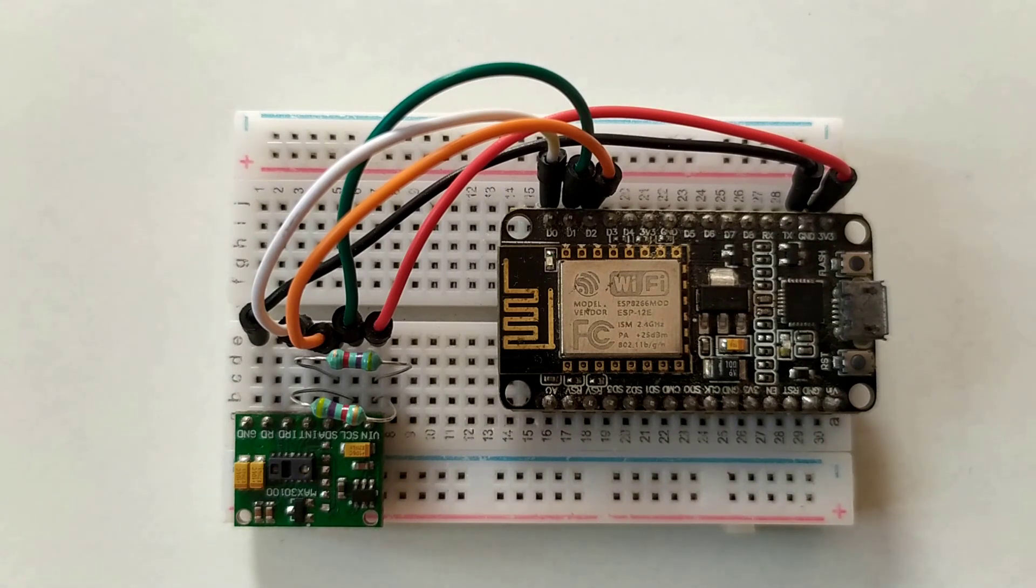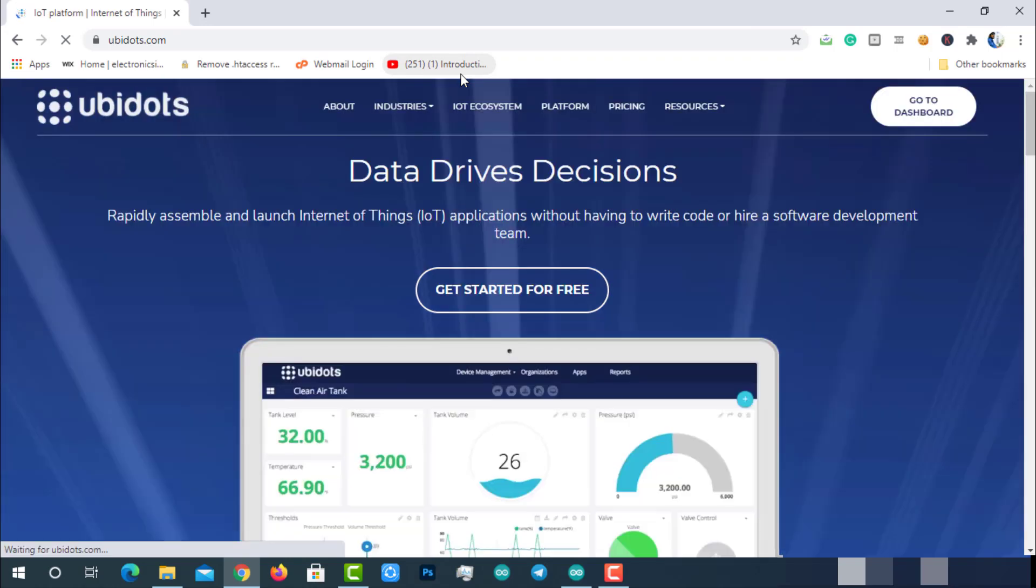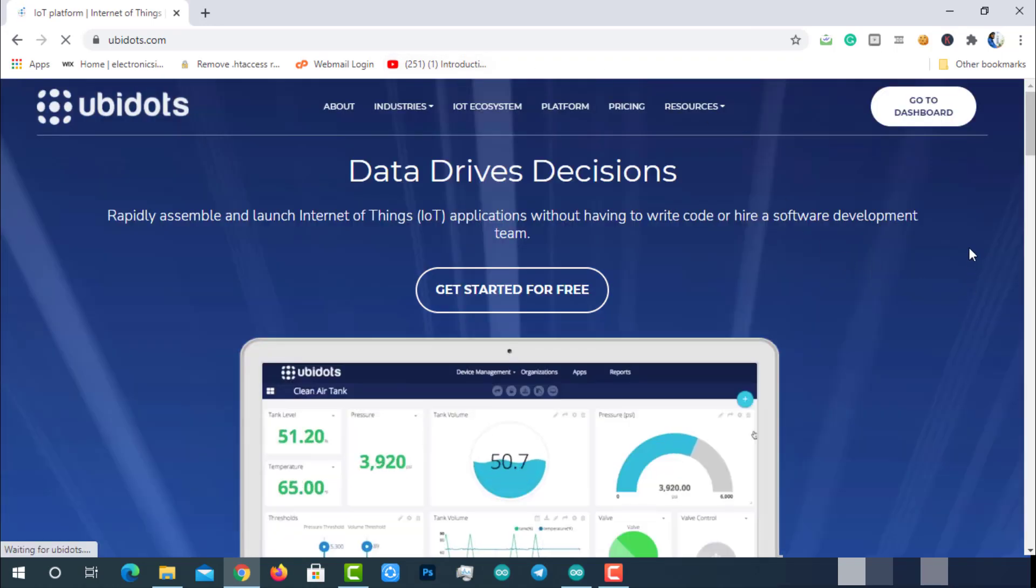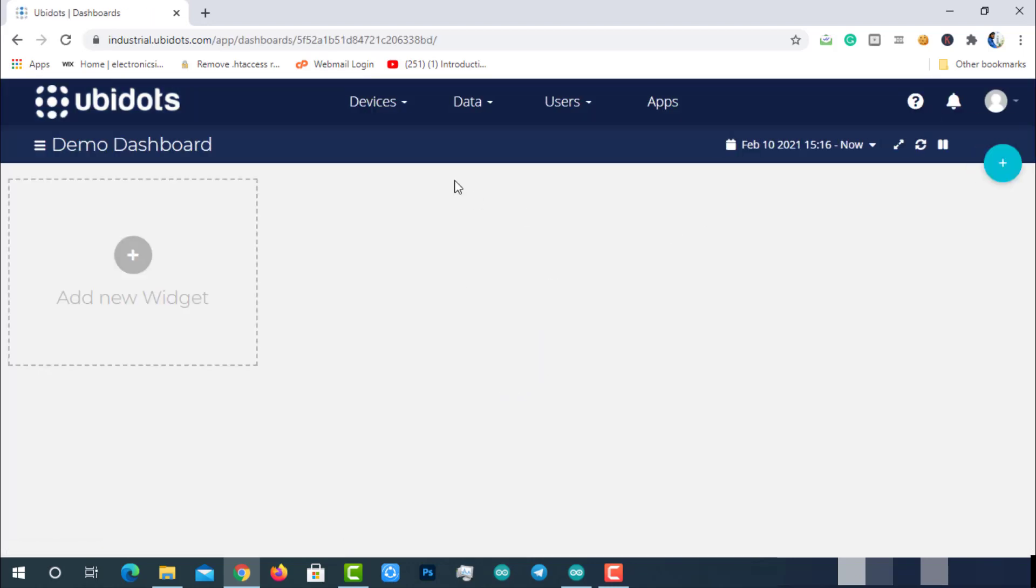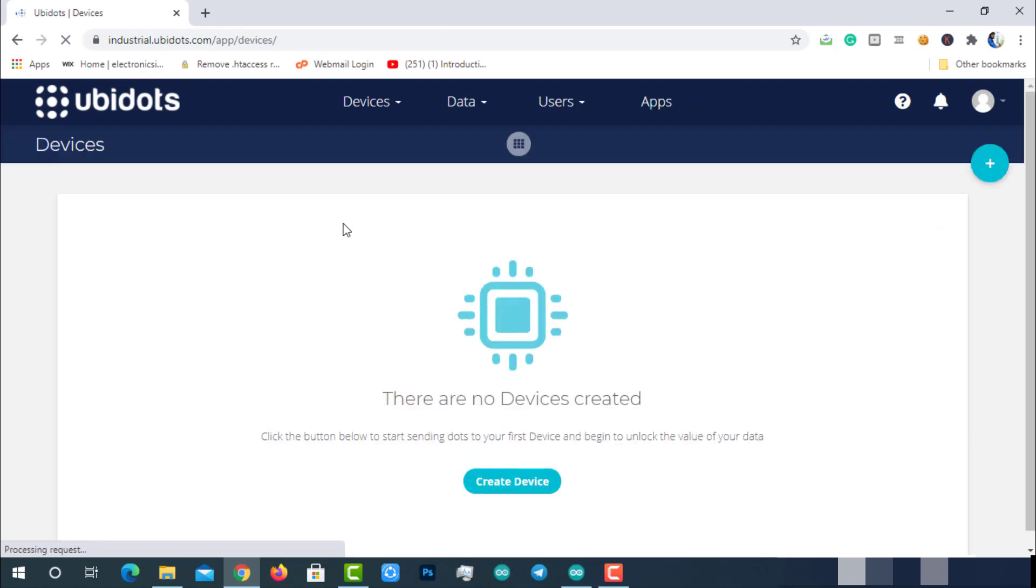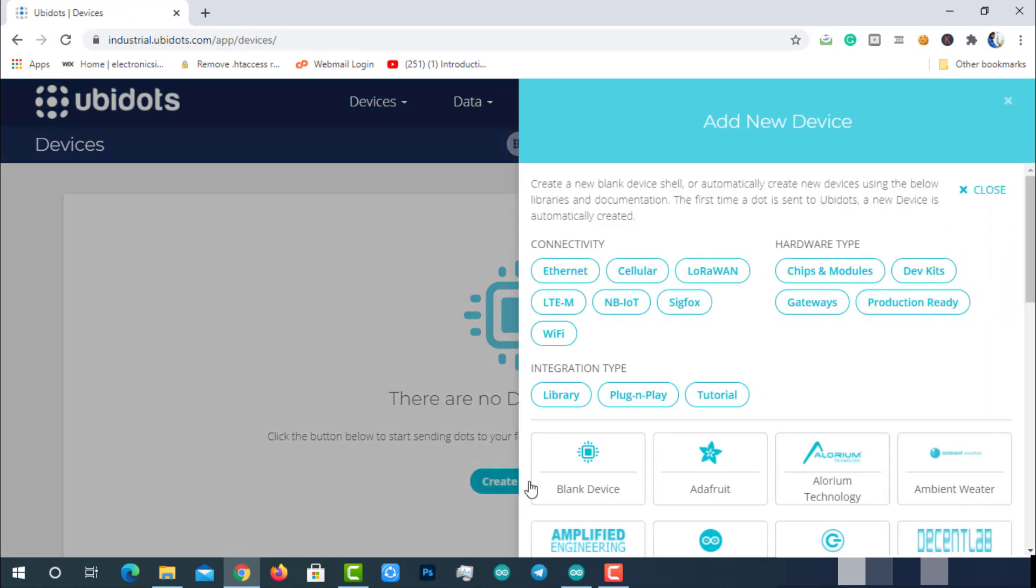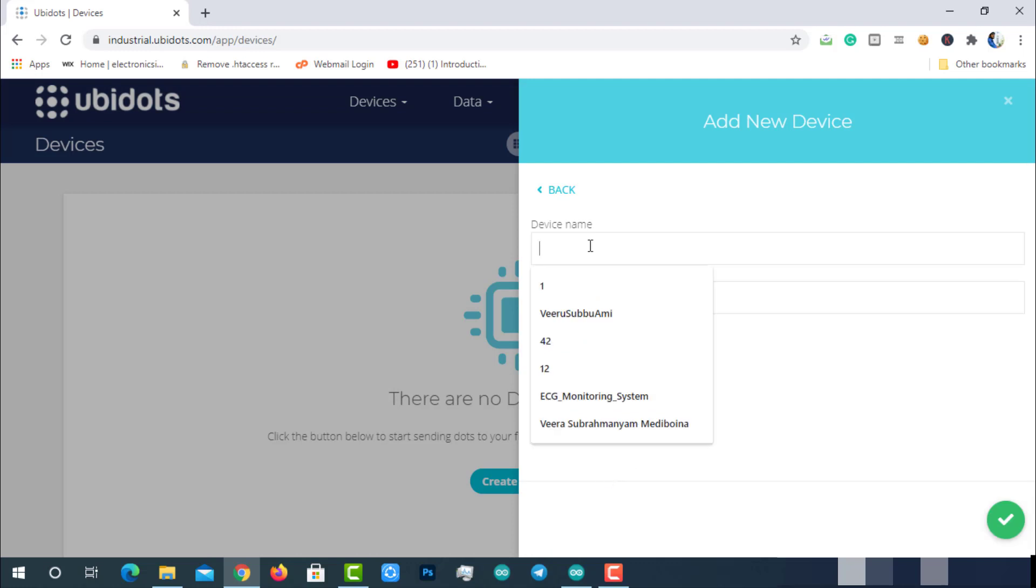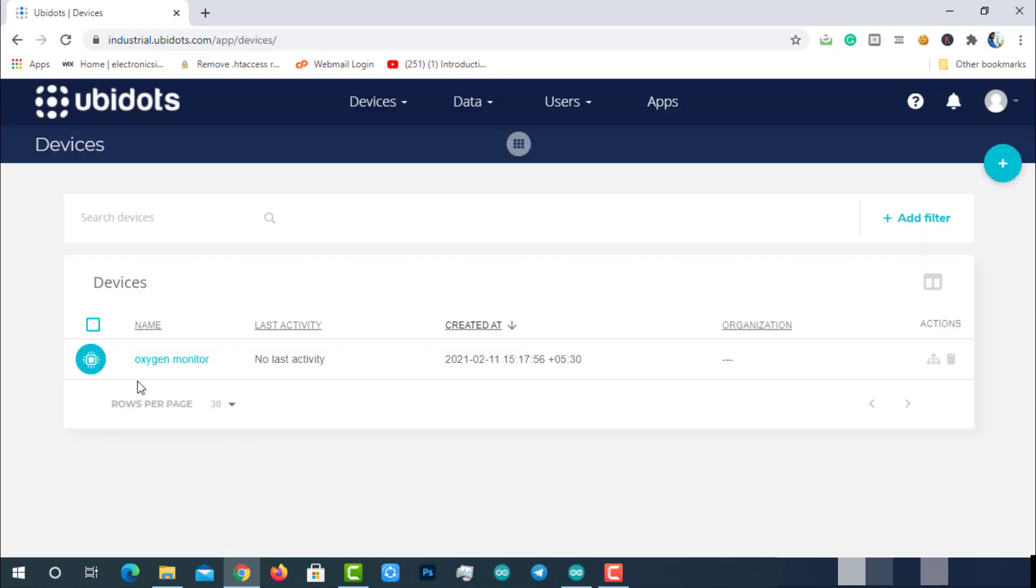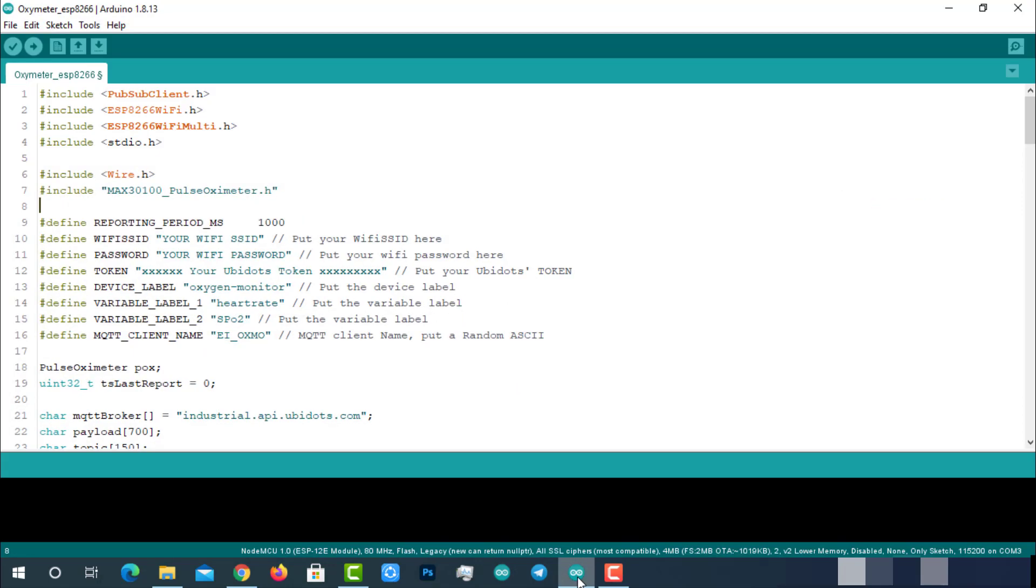Let's create a device in Ubidots platform for our solution. Visit Ubidots.com, go to dashboard, click on devices, create a new device, select a blank device, enter the name for the device, then click on the green tick mark to create the device. That's it! The device is successfully created. Let's move to the programming part.